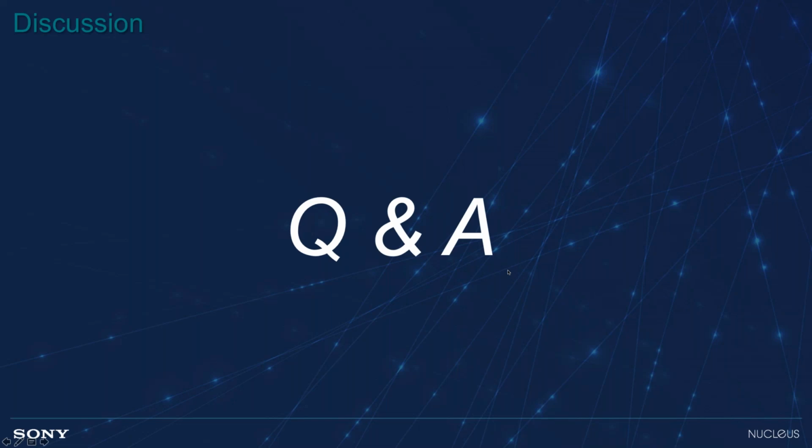Follow-up question, any integration with HL7? Yeah, that's the main means. HL7 is Health Level 7, which is a communication protocol that allows all systems to communicate on the same type of standards, right? So it's not proprietary. It's a well-established standard out there for EMR, electronic medical records. Part of PACS and DICOM also communicates on that modality work list, and our system works readily with that. We have the tools available to work with just about any EMR or EHR system out there.